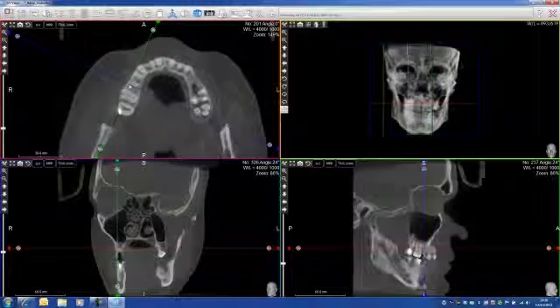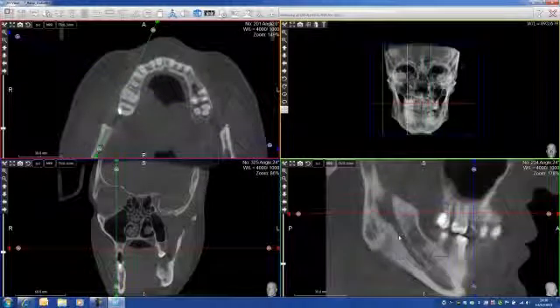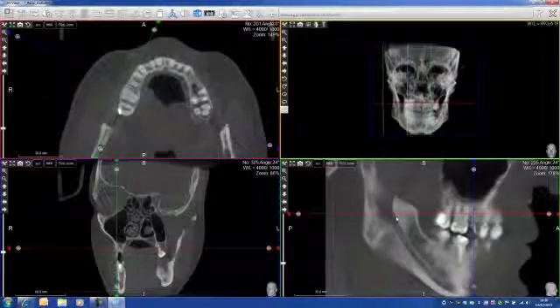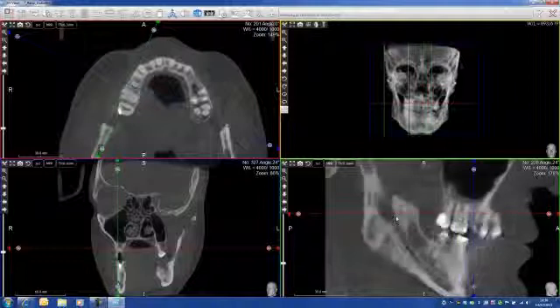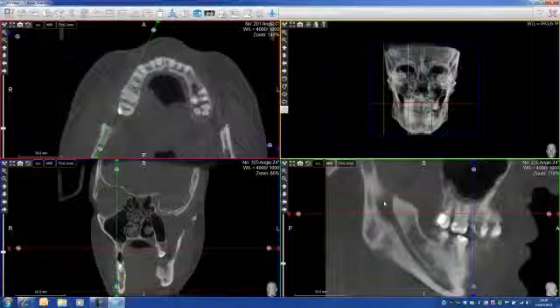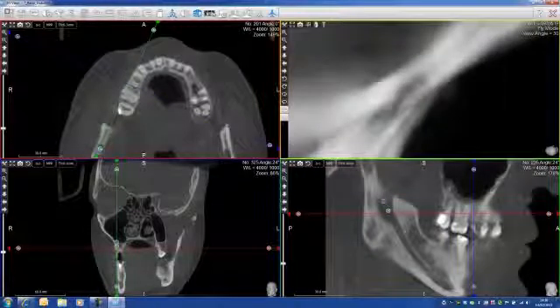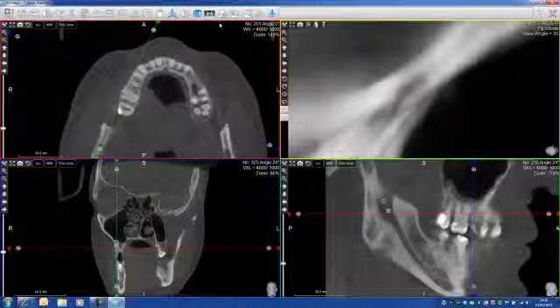I'll show you what I mean. I'll go here — you can clearly see my mandibular canal. I'll go on this little icon here, click here, change the filtering, and go on bone. It takes a bit of time to load.